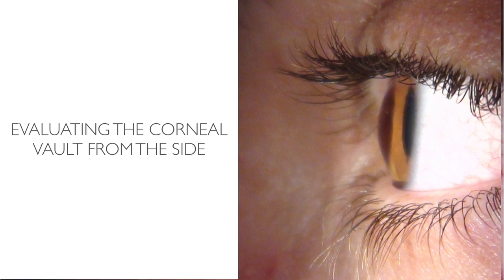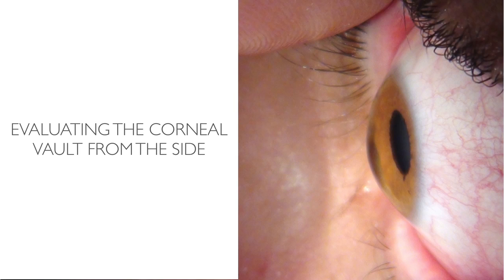So let's evaluate this patient. If we look at that, the cornea is not protruding greatly. I would say that that's a fairly low sag design lens. But I need to see where the lens rests. The lens rests on the sclera, so we have to retract the eyelids, and then we can get a better appreciation of where that lens is going to settle down to. And you see that this patient's sclera is not fairly flat, but it's fairly steep.